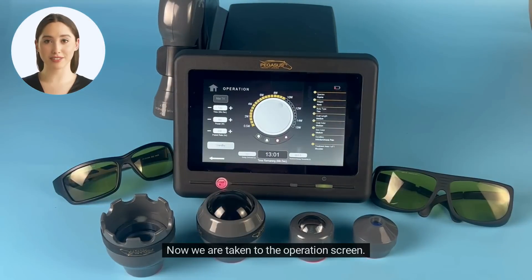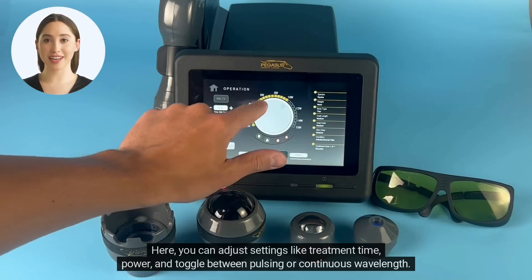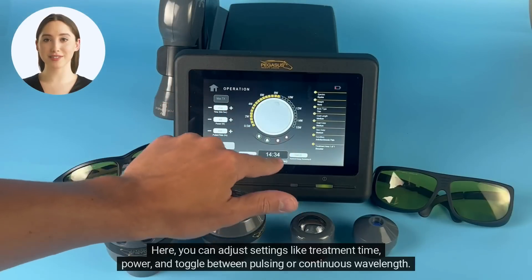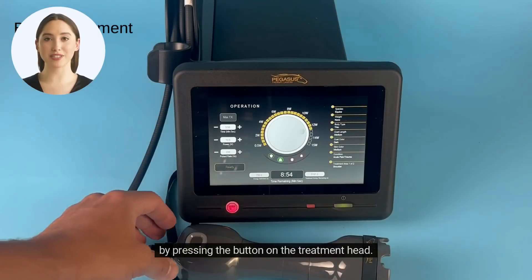Now we are taken to the operations screen. Here, you can adjust settings like treatment time, power, and toggle between pulsing or continuous wavelength. Once you've set your parameters, click the ready button on the screen, and you can begin treatment by pressing the button on the treatment head.